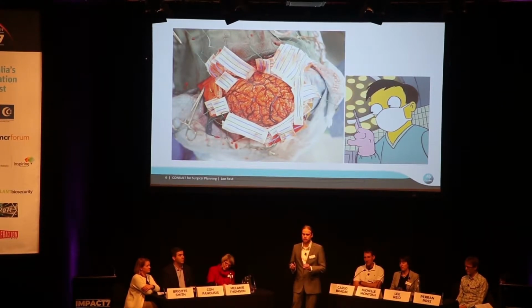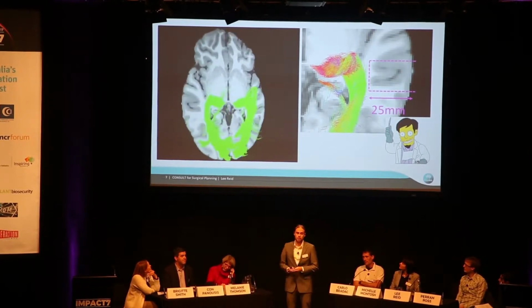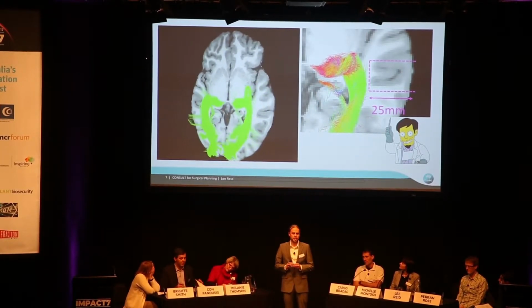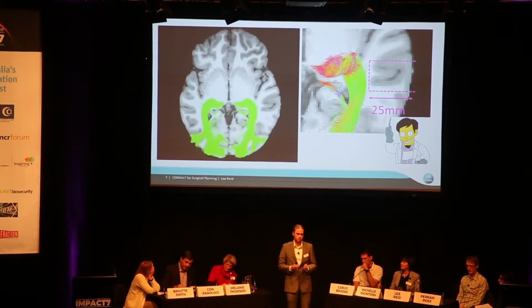Enter Consult. Consult is software that I've written that extends what an MRI scanner can do. So rather than getting these boring white and gray images, we get a full 3-dimensional reconstruction of the wires in a particular person's brain. It's even color-coded. So for example, on the top left here, the green lines indicate the wires that let this particular person see.